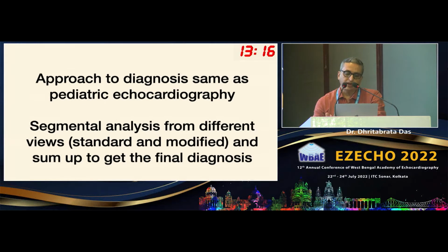Now, approach to diagnosis is same as in pediatric echocardiography. So we do a segmental analysis of different parts of the heart from different views. Some are standard views, some may be modified views, as we use in our daily pediatric echocardiography as well. And we sum up all the findings to get the final diagnosis.